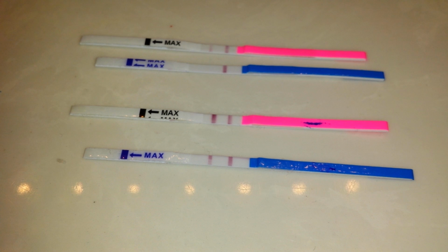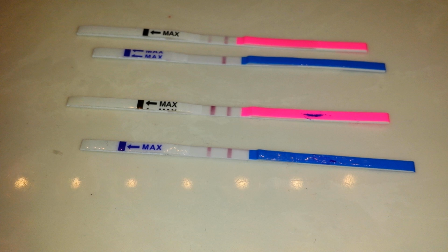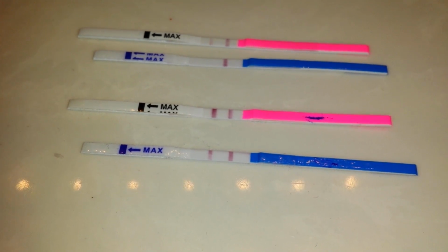And yes, I do believe you can use an HPT as an OPK, or an OPK as an HPT, if you are further along in your pregnancy.